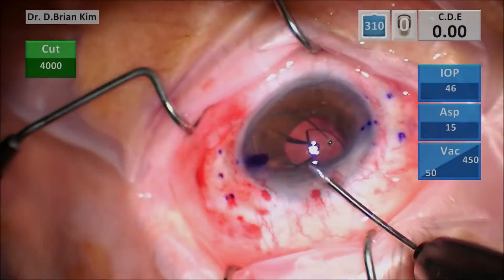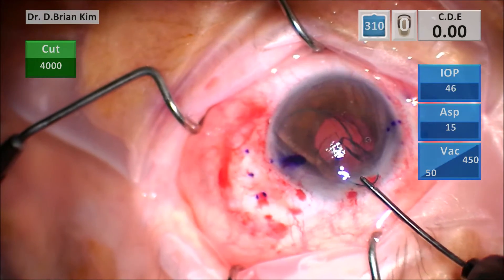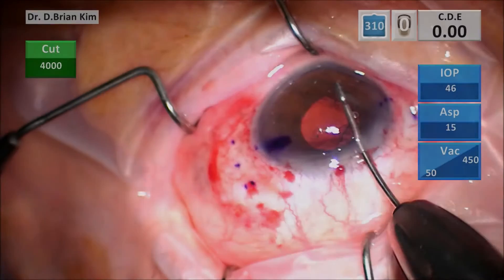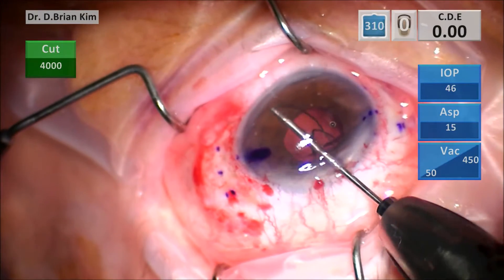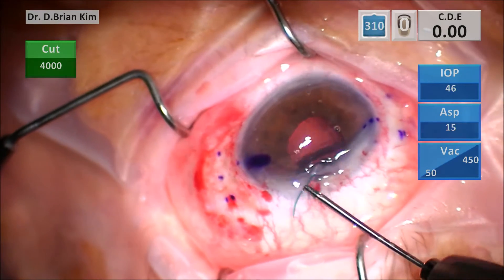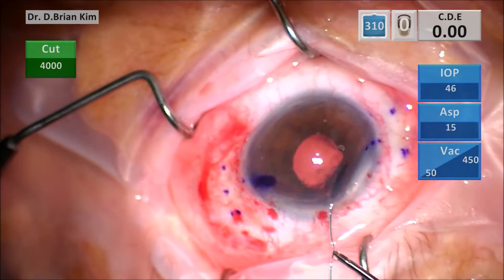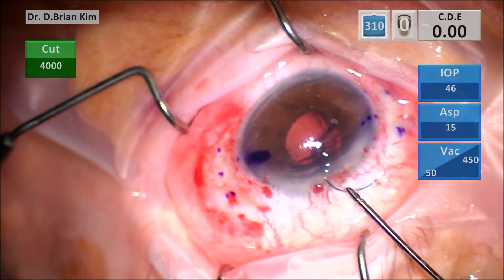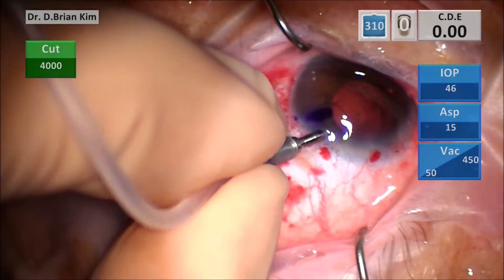I bisect the intraocular lens and use my intraocular forceps to remove each piece. The second piece has the haptics away from me, and to make it easier I grab the haptic. However, in doing so I realized that the optic is getting caught on the iris. Thankfully I didn't put too much traction, so I was able to rotate the optic and get it out pretty easily.